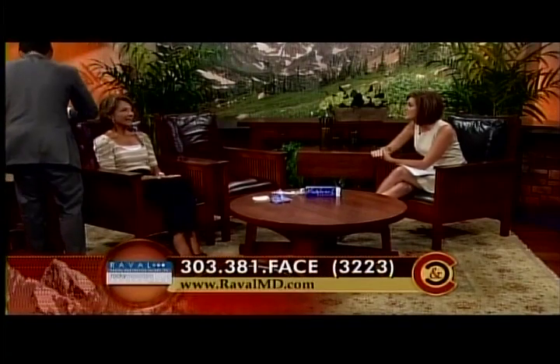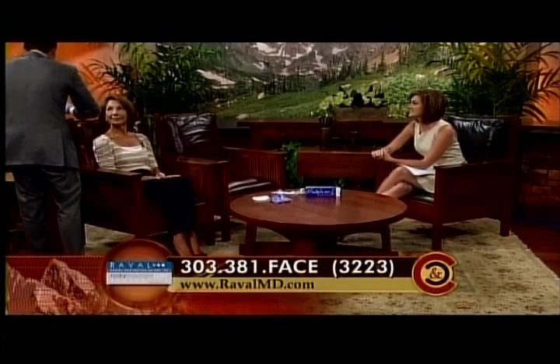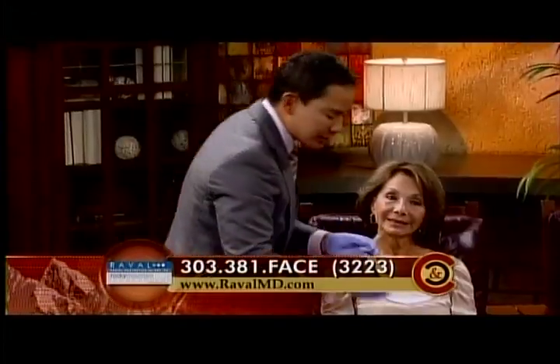Are you nervous at all, Carol? No, I'm not actually. Okay, and then a bunch of great things. Restylane now has a new needle that's much smoother. It glides much better. It's much sharper. Believe it or not, the sharper the needle, the less pain.